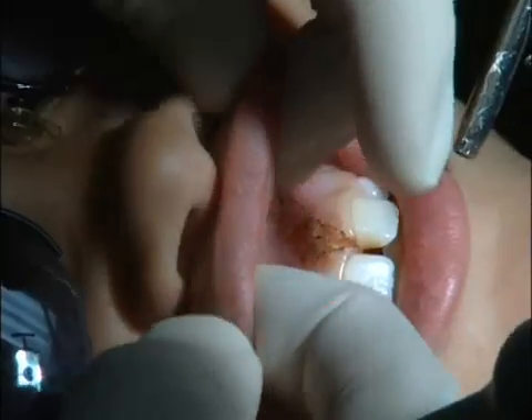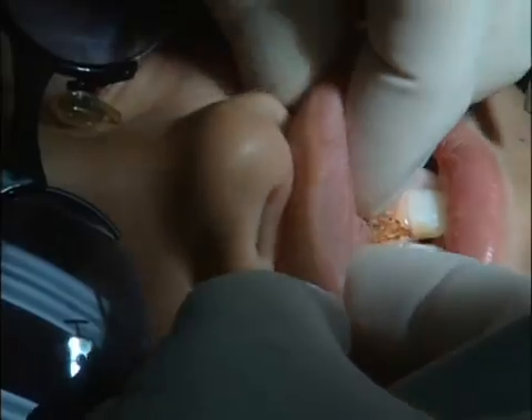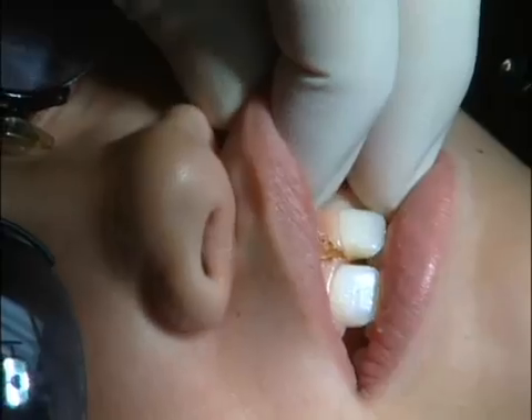Now I've created a little more lateral freedom. Basically I'm at a point where I'm five to six millimeters of keratinized tissue free, down to the bone and in between the teeth where that muscle attachment got really thick.